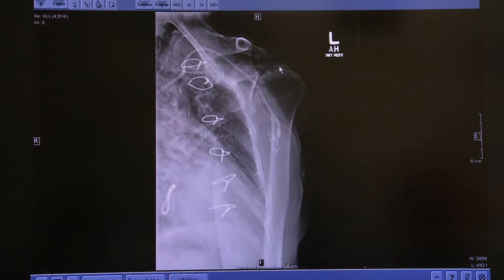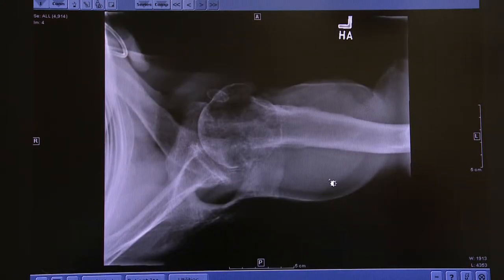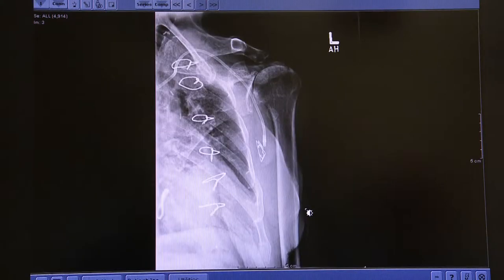You can also see that there has been articulation between the humeral head and the acromion. Notice the acromion has remodeled and is cupping the humeral head. This has been called acetabularization of the acromion. This is the axillary view, and the plan is to perform a reverse shoulder arthroplasty.